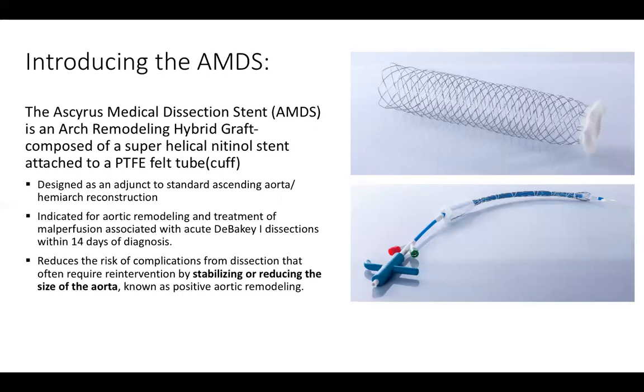I met him several years ago when he was just starting out, and he was extremely passionate about it, and has seen it through to fruition with a lot of work, and has developed this stent called the AMDS stent, and called his company Ascyrus. His boy is actually named Cyrus, so that's how he got the name of his company, Ascyrus, and that's AMDS, Ascyrus Medical Dissection Stent.